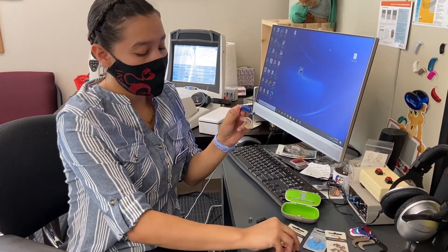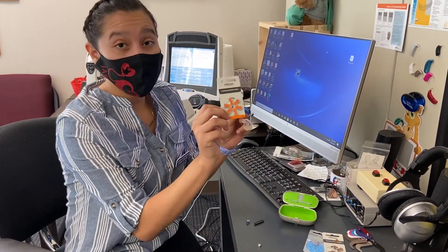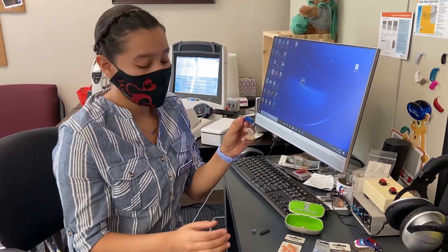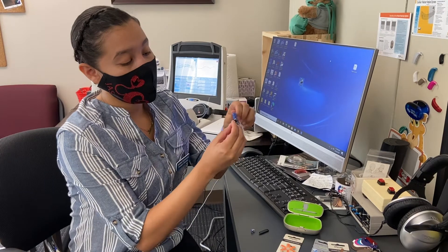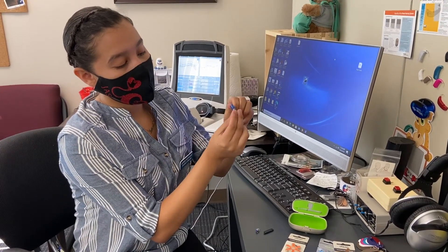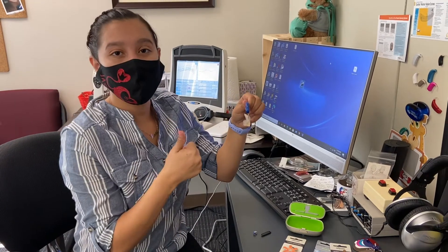This is a fresh packet of batteries. Once you take out the sticker, it's very important to wait two to five minutes to let the battery activate. Once we have waited, kindly place the battery flat down, close, and you're good to go. Let it activate.